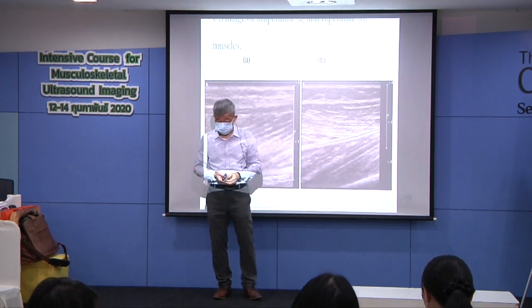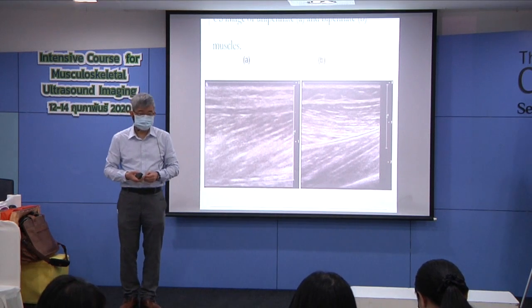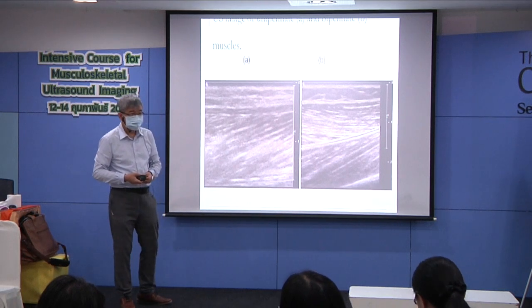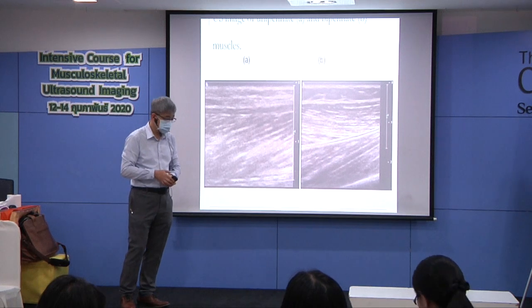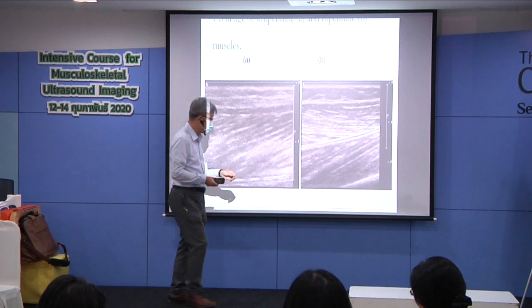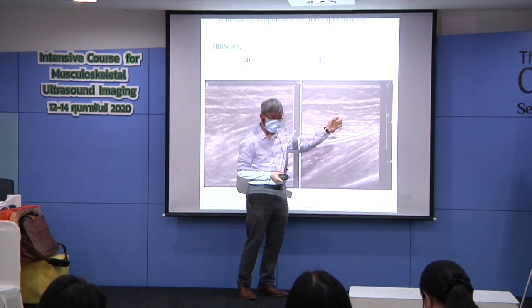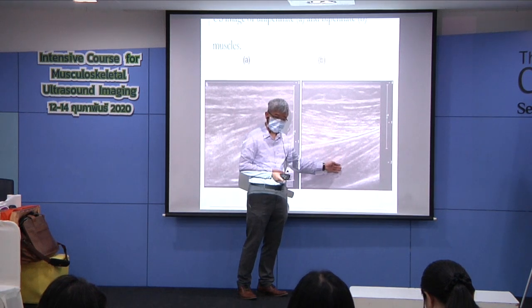I know there are some motorcycling accidents. It's very common in Taiwan as well. So when a case with motorcycling injury, and they tell me they got hit on the lower leg, we often use ultrasound to check the range of the injury. Is it the superficial layer only or the deep layer as well?